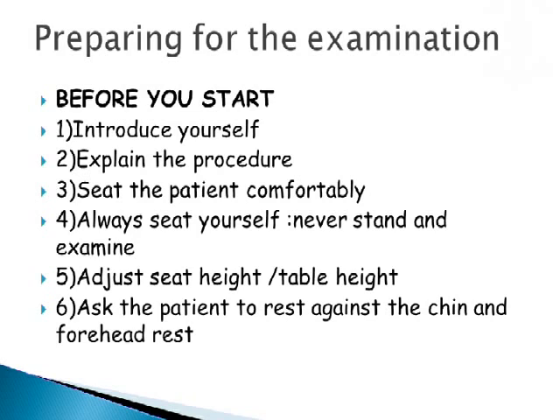Again, seat yourself comfortably. Never stand and examine. That can cause sometimes severe neck ache and can be really bad. Adjust the seat height, the table height. Ask the patient to rest against the chin and the forehead rest. Nowadays, in fact, there are these disposable tissue papers for chin, because after an examination, sometimes the chin rest can get soiled because of sweat at times. So that's why there are disposable papers which have to be removed every time you're doing an examination.